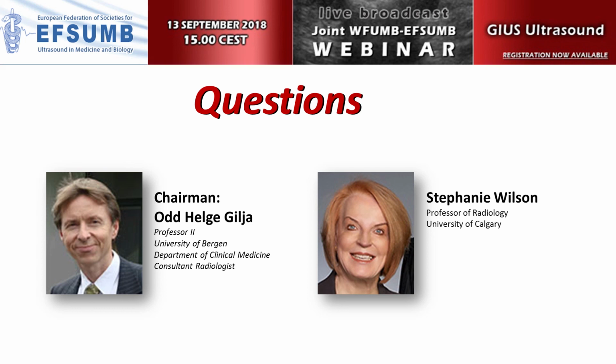Okay, thank you. And then a final question regarding also elastography here. What about patients with acute on top of chronic disease? Can you use shear wave elastography to differentiate? I believe that acute on chronic disease is a challenge for certain. However, the tendency for patients with long-standing inflammatory change to develop fat in the submucosal layer of the bowel is very suggestive of chronicity on ultrasound, as it is, of course, on CT and MR scan as well.